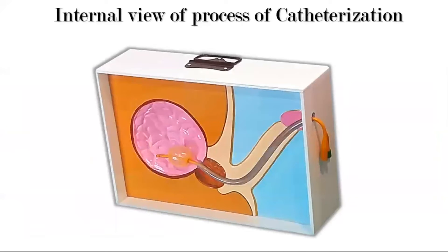This model gives a clear mid-sagittal view of the urinary bladder and male urethra. Transparency of the urethral tube allows viewers to see the exact location of the tip and balloon of the catheter, while the hemispherical hollow of the bladder accommodates the inflated balloon.